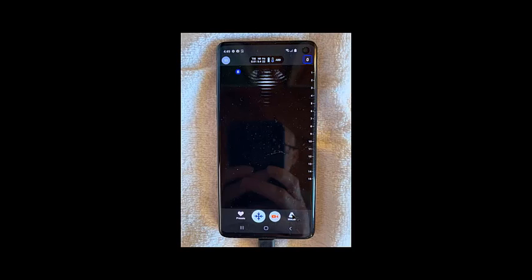Mode, you're always going to use B mode, of course. This is for recording images. The legal eagles from the hospital have asked us not to record any images because BFLY has a cloud and they're concerned about that. Once they figure it out, we might change those instructions, but don't hold your breath. It's a legal thing, of course. So that's your basic tour of the screen.